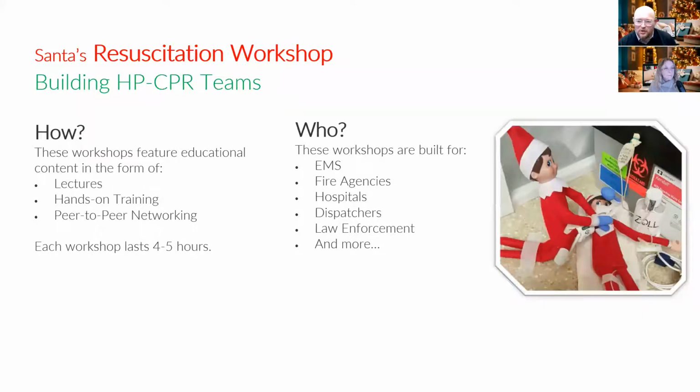Let's just go back to one of the HSL webcasts that we just did. We actually had Mr. Mike Helbach on from the Resuscitation Academy, who talked about high performance CPR. This is kind of like a workshop for that. Is that what this is, Alyssa? The Resuscitation Academy actually does a form of this workshop within the Academy. They do a lot of things quite similarly; as a standard, they use our QCPR technology with SimPad. So it is quite similar, but we actually partner a lot with some distributors, customers, and agencies.